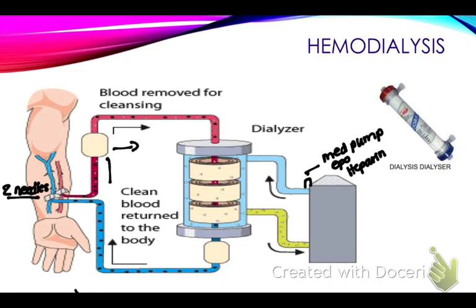And often there's a heparin as well, because again, you got to keep it heparinized so that it's not clotting up in the tubes and in the machine. So all of that will be there. They'll be on a heparin drip as well. It's very diluted heparin, but they are definitely on heparin during this process.